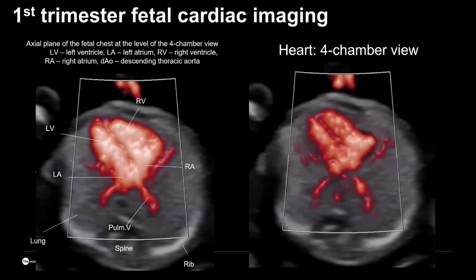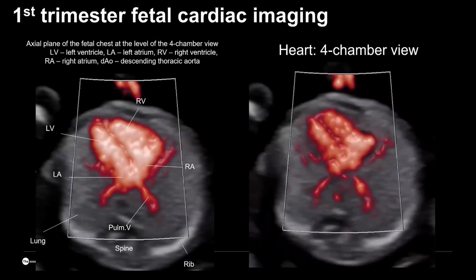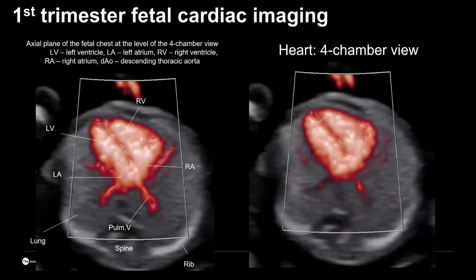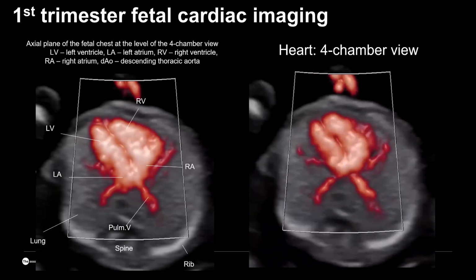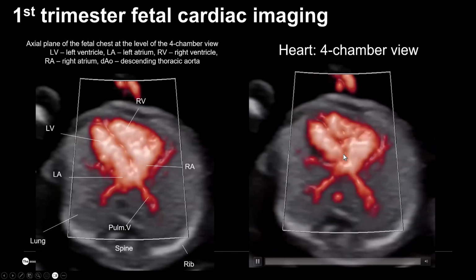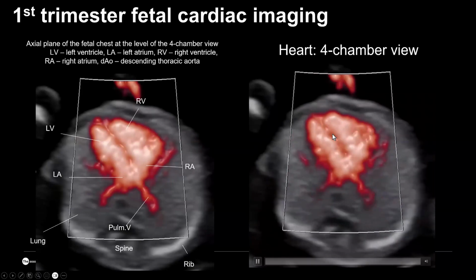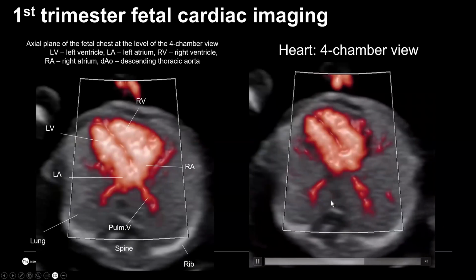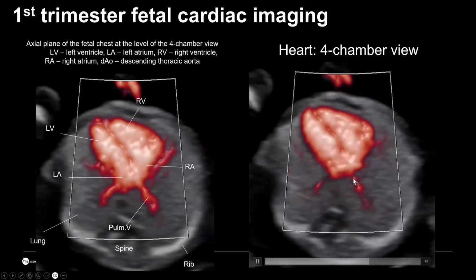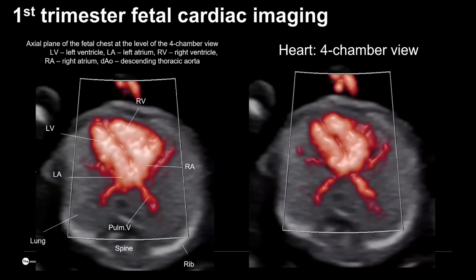Also, the advantage of the microvasculature type of Doppler, the MV flow, is critical for the assessment of the heart at that early gestation. You can visualize the septum, at least to confirm that it exists and doesn't show significant defects. You can identify the position of the aorta. You can see the pulmonary veins, and this fetus is just 13 weeks gestation.